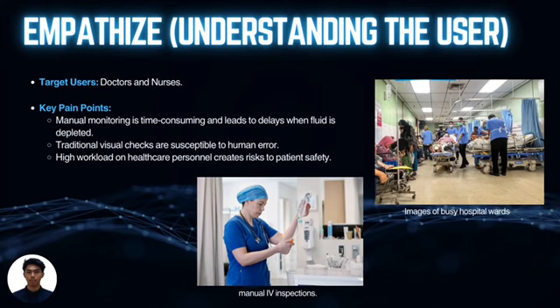We realized that manually monitoring IV fluid levels is time consuming and prone to human error. More critically, if an IV bag runs empty unnoticed or the flow stops unexpectedly, it poses severe risks to patient safety, such as embolism. Healthcare staff are burdened and need a way to monitor patients effectively without being at the bedside 24/7.